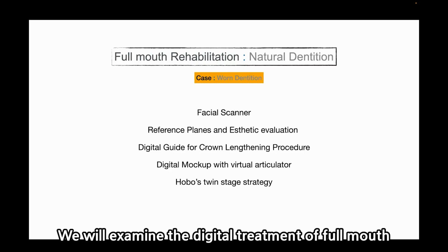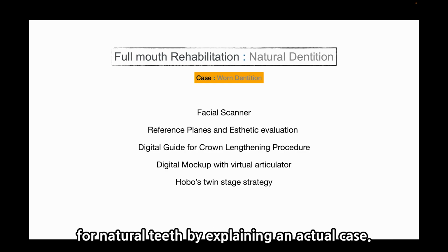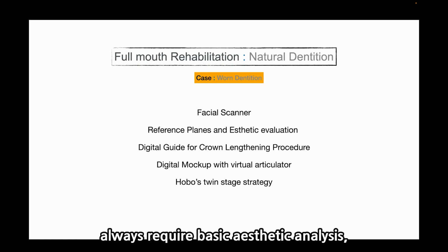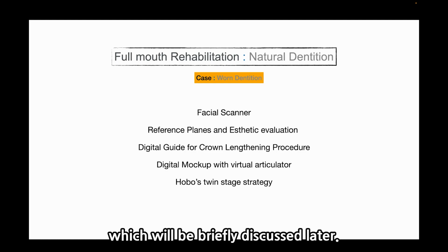We will examine digital treatment of full mouth for natural teeth by explaining an actual case. Natural teeth or implant retained prosthetics always require basic aesthetic analysis, which we'll briefly discuss later.